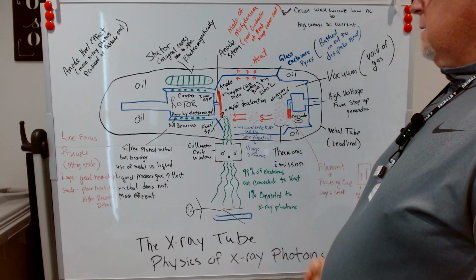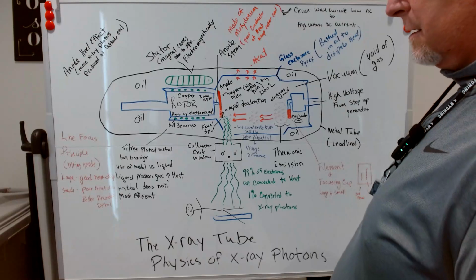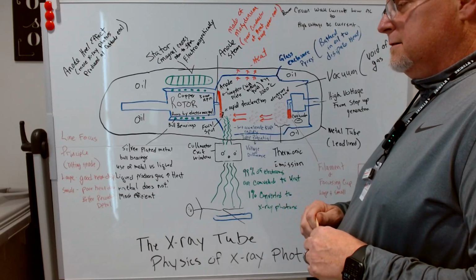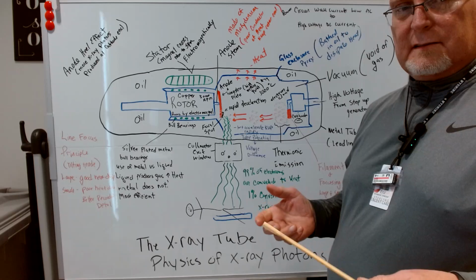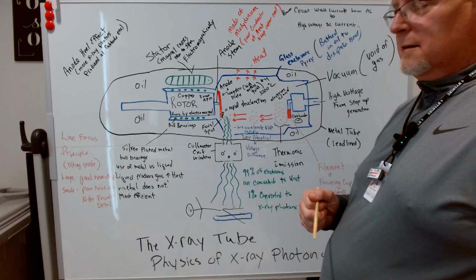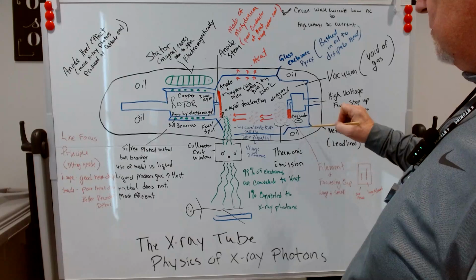And the X-ray tube itself is actually encased in glass. It's a very sturdy, heat-resistant glass. A lot of people have described it as a Pyrex type glass or some type of Corningware. It's a glass that is very heat resistant and strong.